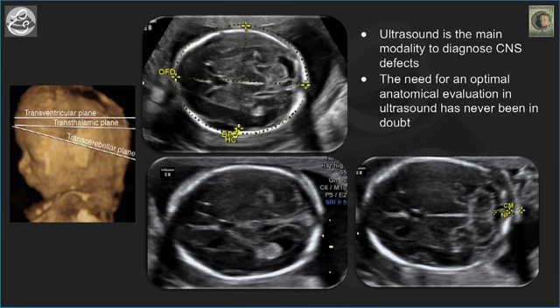What is central to all these three planes, and you must understand that, is that each one of them will actually show you the cavum septum pellucidum. So none of these planes should be identified unless you use that cavum septum pellucidum at its center.